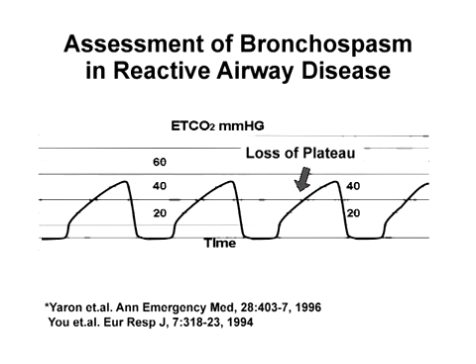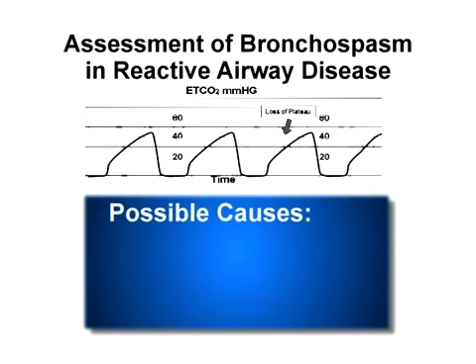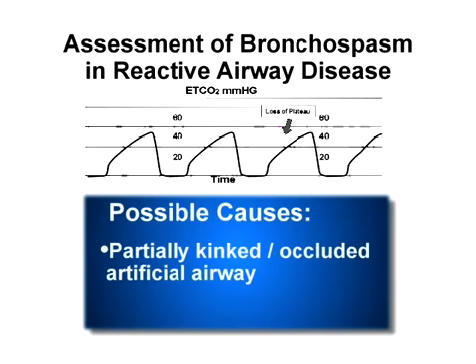A typical waveform shows the loss of the alveolar plateau and an elevated end-tidal CO2 value. This capnogram shape can be caused by obstructions such as a partially kinked or occluded artificial airway or the presence of a foreign body in the patient's airway.